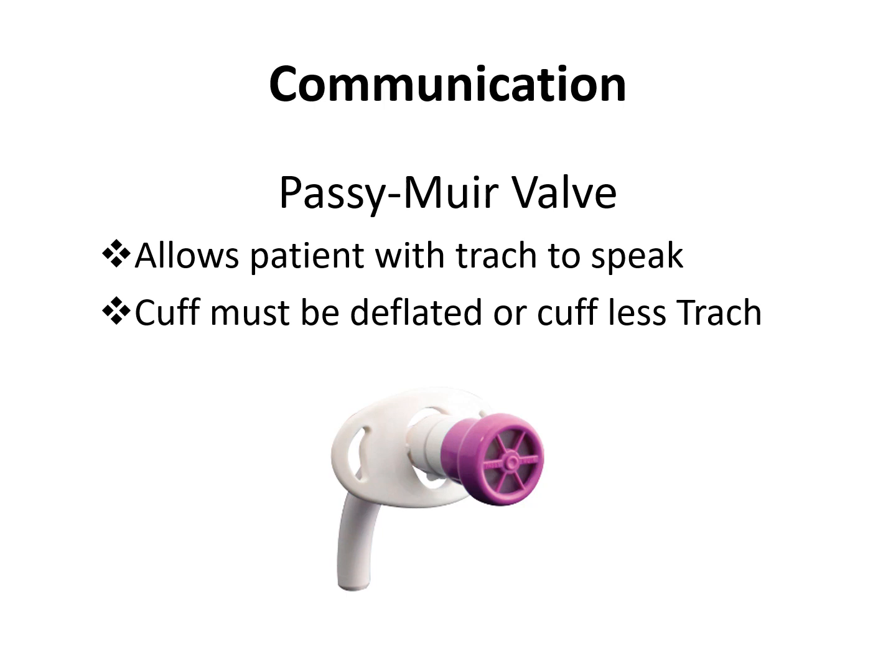So there's a lot of collaboration between your respiratory therapist and your speech therapist when they're using a Passy-Muir valve. It's not meant to stay on the patient all the time. It's usually reserved for those times that the patient wants to communicate with either family or the doctor or the nurse, but it's not meant to stay on all the time.